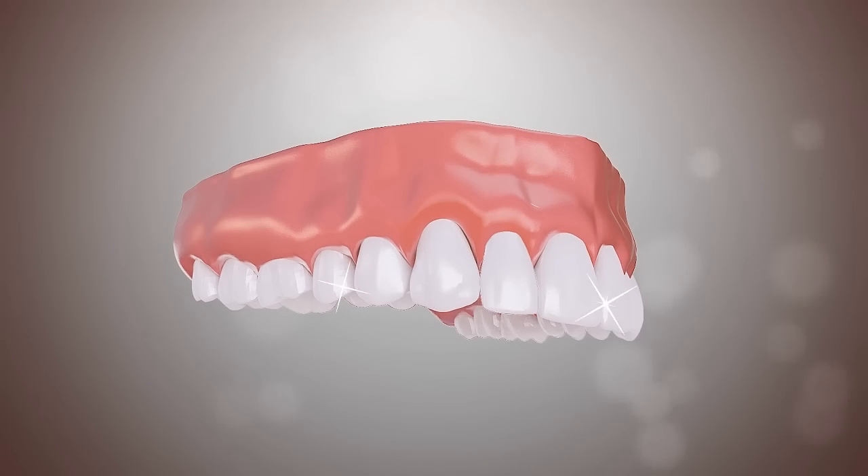The new implant looks and feels like a truly integral part of the mouth. Please contact your dental professional today to see if dental implants are right for you.